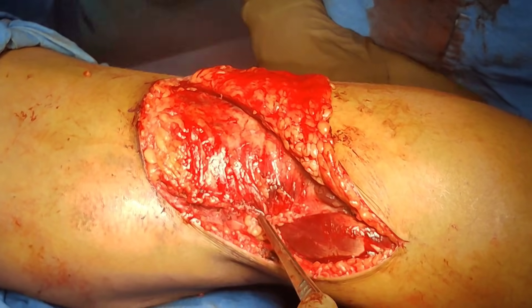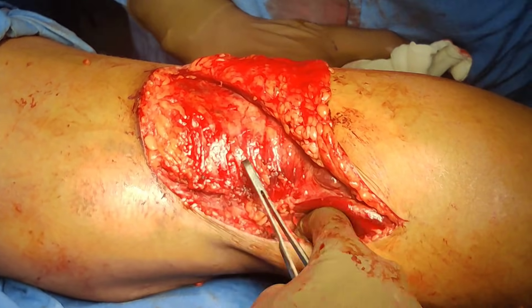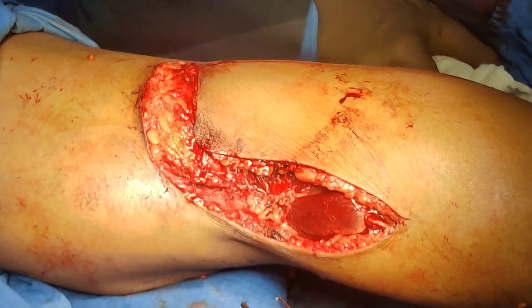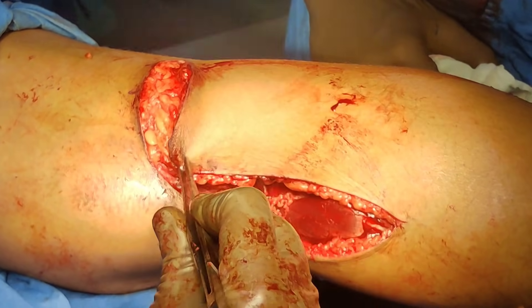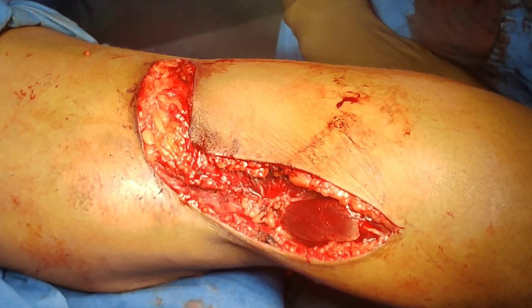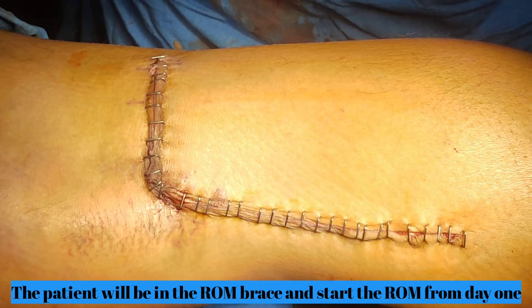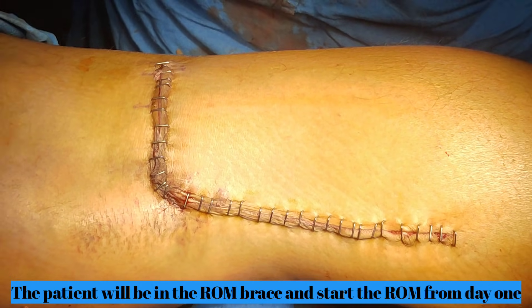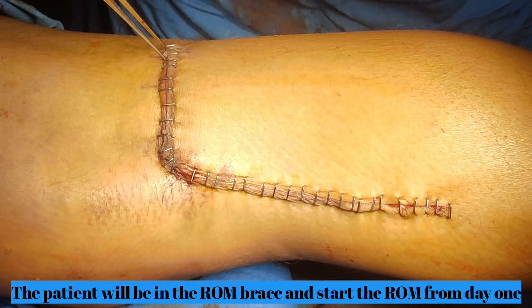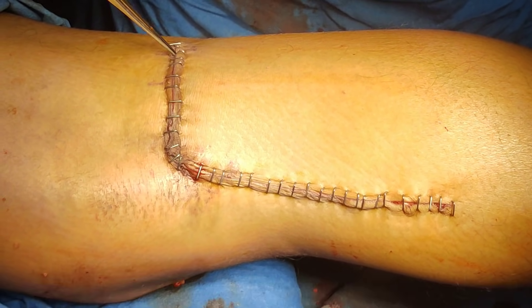We managed to close the fascia up to here; here it is very flimsy and just cutting out, so I've just left it. Now running a corner stitch and then it will be routine closure for the skin. This is our skin closed — this is how you do a posteromedial approach in a prone position.